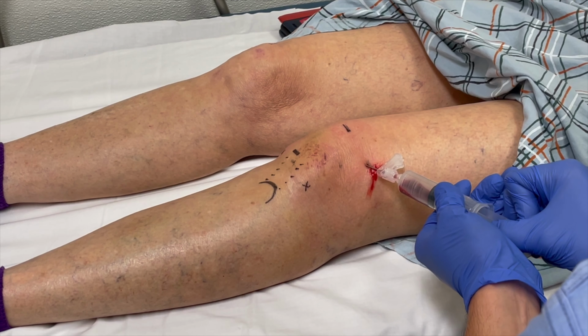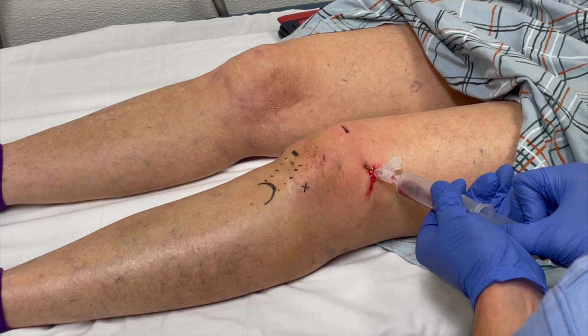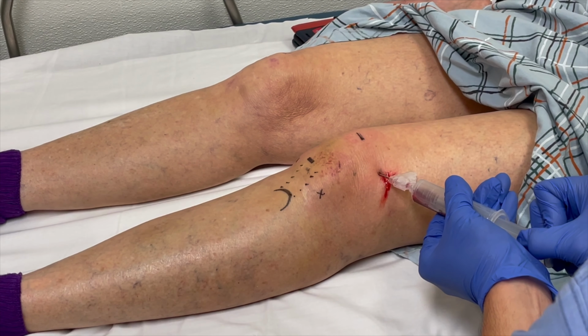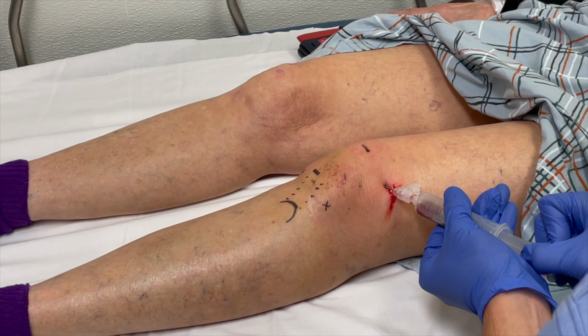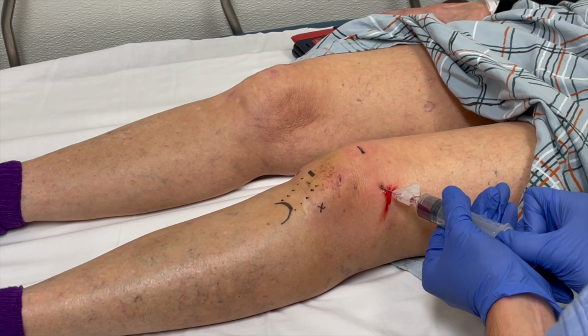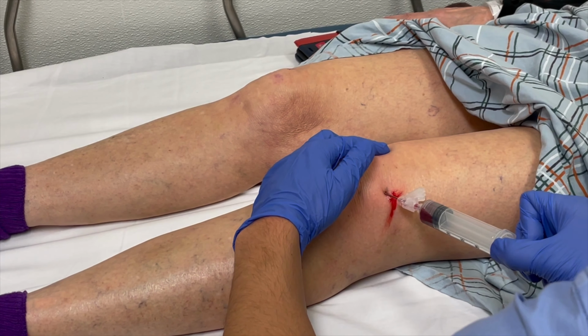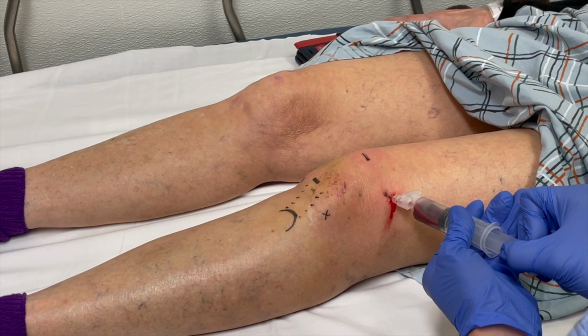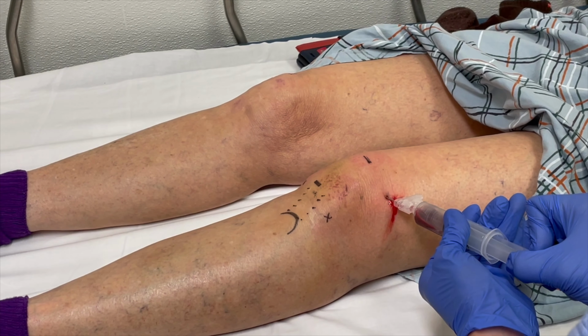When aspirating for infection, there is no need for a lidocaine injection following aspiration, unlike in this case for fracture analgesia. In this case, a 20 cc syringe was used, and about 10 cc's of hematoma from this patient's patellar fracture was aspirated.